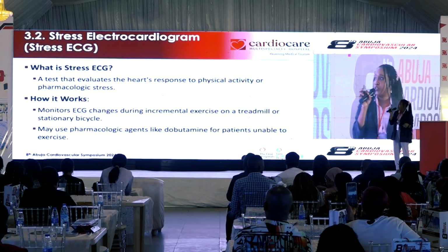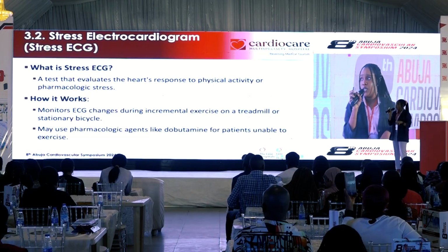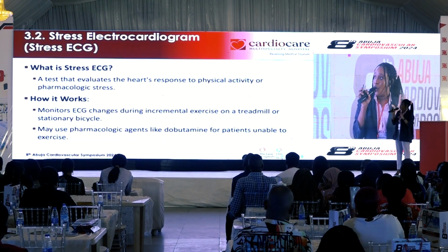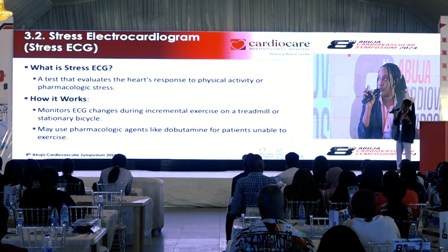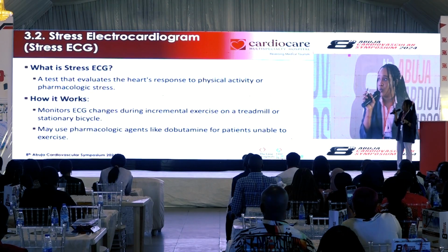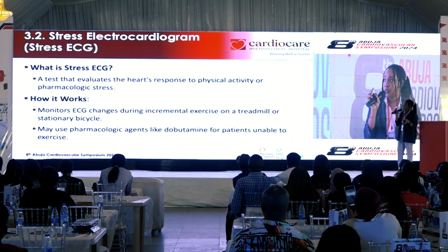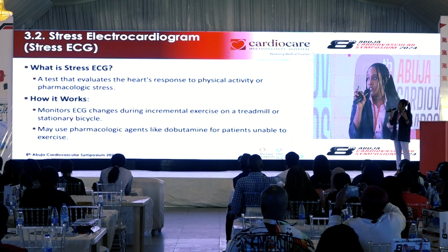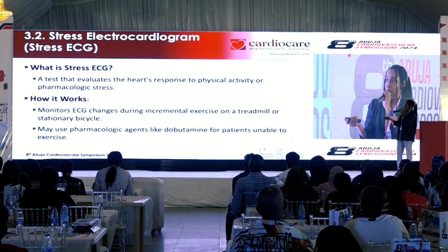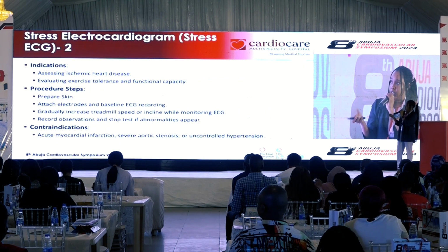So moving on to our next procedure, stress ECG. Stress ECG is a test we do to monitor the electrical activities of one's heart while under stress. Is it the physical activity or the pharmacological stress? How this works basically is we monitor the ECG changes on either a treadmill or stationary bicycle, or even with the use of dobutamine as our stressor agent.